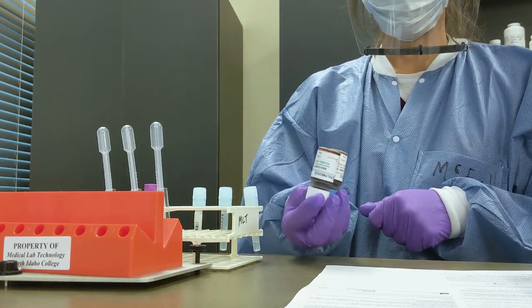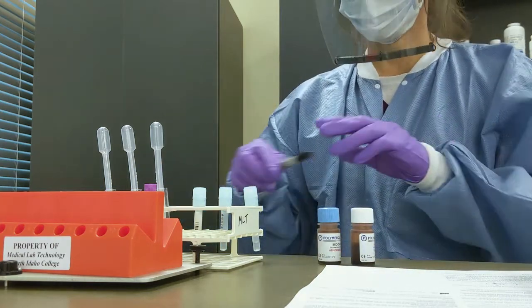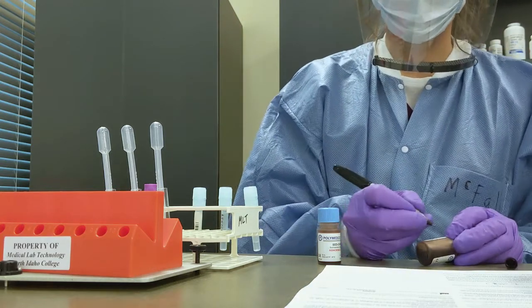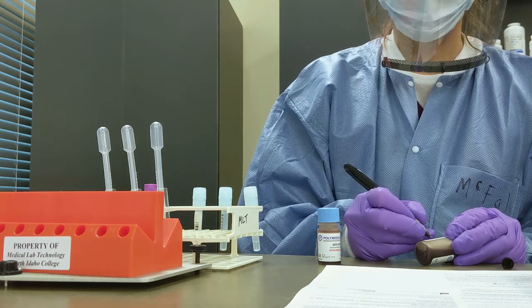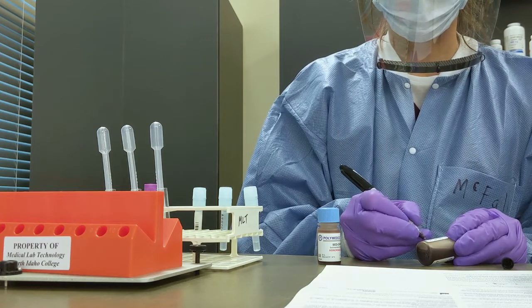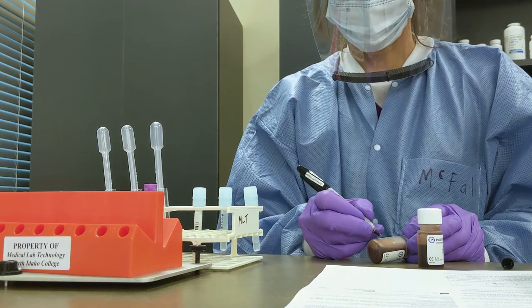She's going to set up three samples — the controls and a patient. Since she's just opening these reagents, she's going to date, time, and initial them. That way we know how long these controls are going to be good for, again depending on what the manufacturer insert tells us.